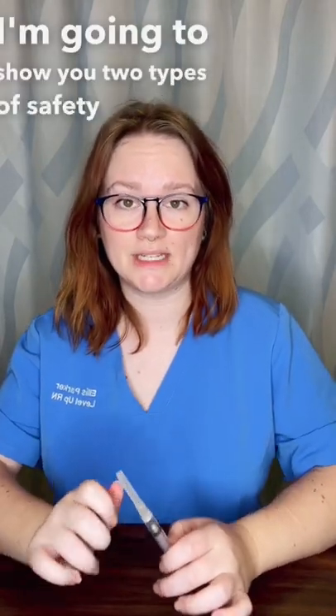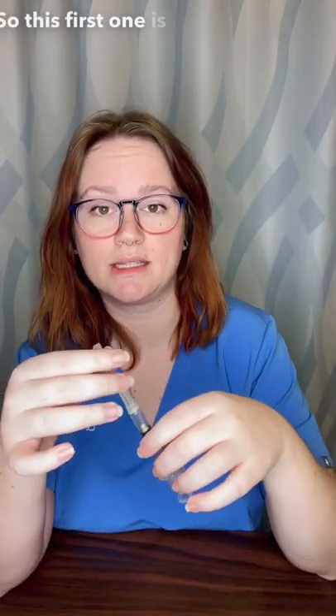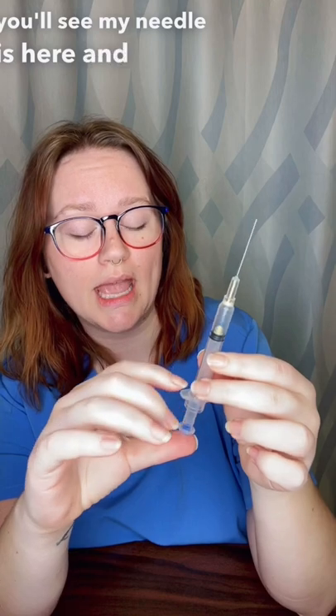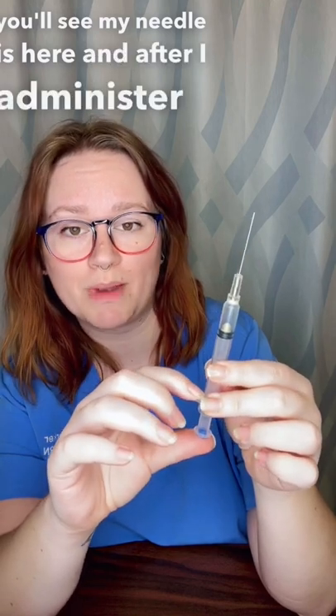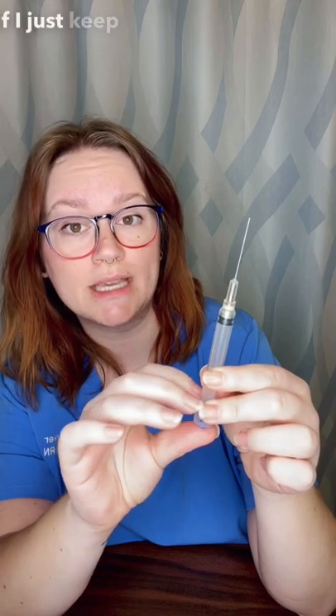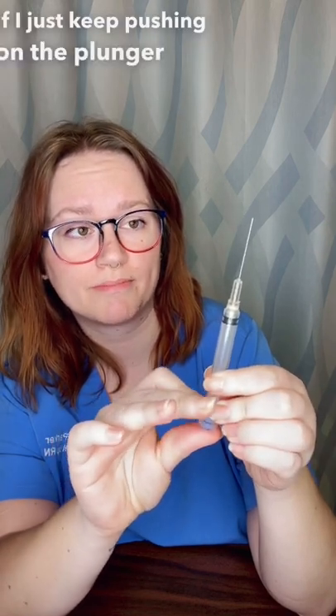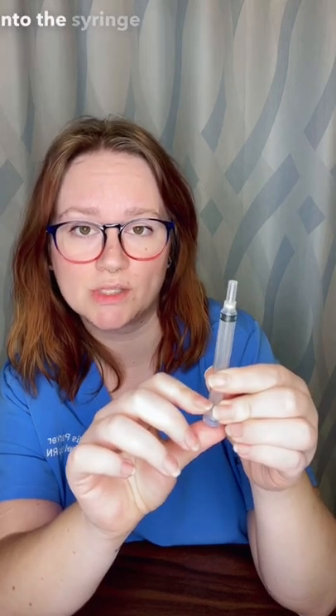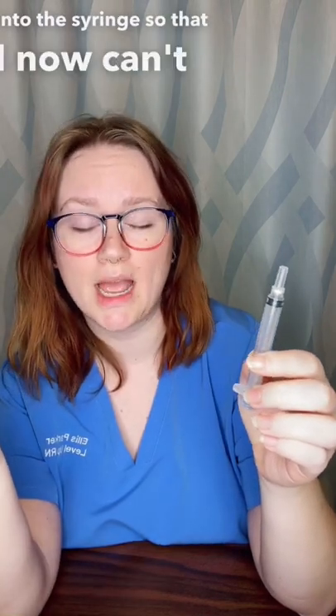I'm going to show you two types of safety needles. This first one is one where the needle vanishes. You'll see my needle is here, and after I administer my medication — so there I'm administering my medication — if I just keep pushing on the plunger, the needle retracts into the syringe so that I now can't have a needle stick injury.